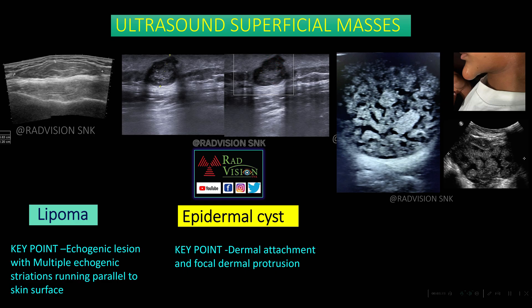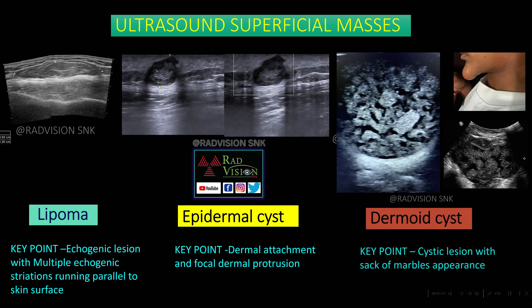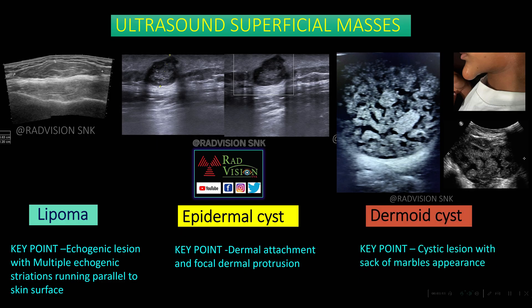This cystic lesion is noted in the neck, specifically in the floor of the mouth. Whenever you see cystic lesions in the floor of the mouth or neck region with multiple echogenic bar-like structures within it giving a 'sack of marbles' appearance, this is a case of dermoid cyst. These are the common superficial soft tissue masses.